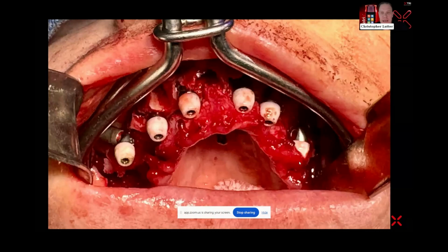Actually, I would just get you the adapters now. So I would just give you an adapter that you put right on top of your matrix implant, and you'd use your exact same scan bodies you have today, which is fantastic. I see. Currently I had the ones for the PIC and the iCam, which have worked quite great. Yeah, I knew that you had to use an adapter for the mapper.